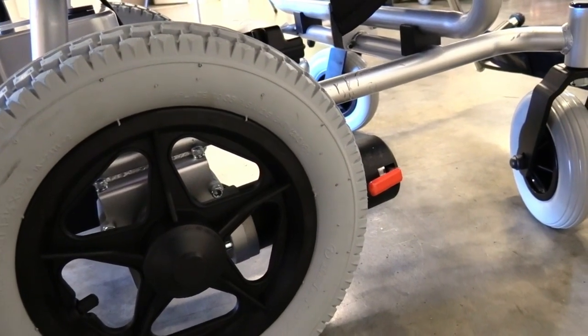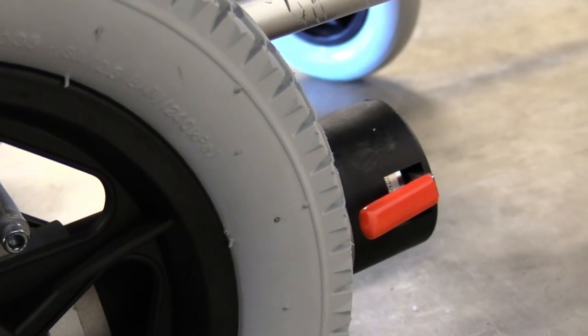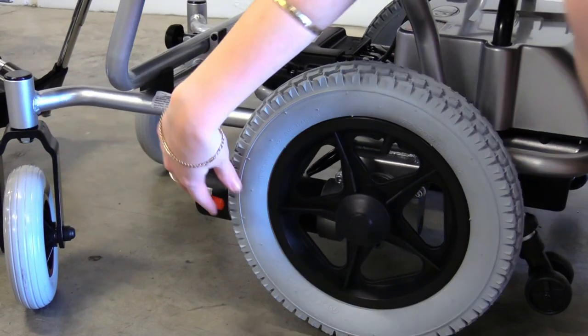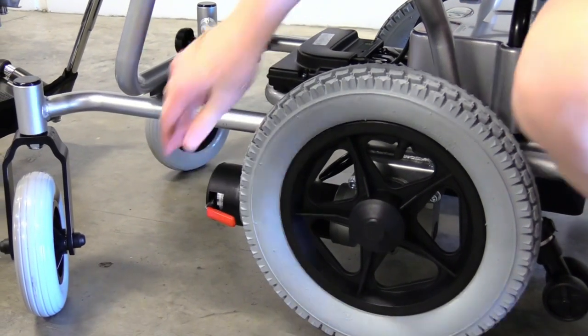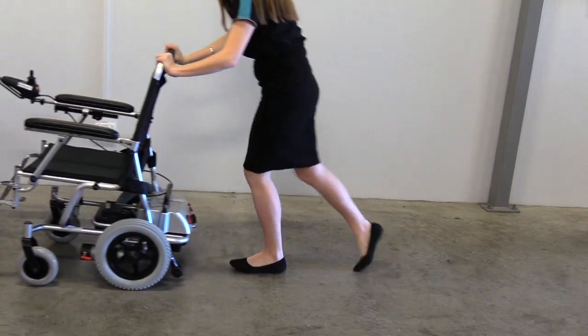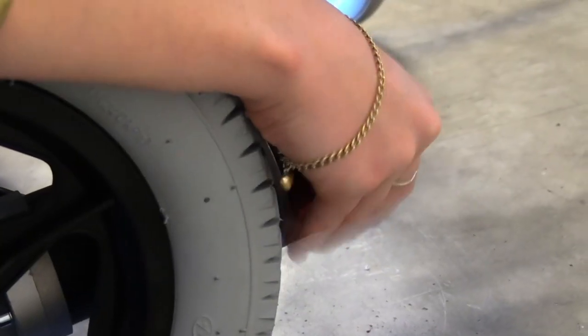To activate freewheel mode on your Puzzle, locate the red levers near the back wheels. Push the levers down on both sides to activate freewheel mode. This means you will be able to push your wheelchair manually. To take it off, simply push the lever up again.